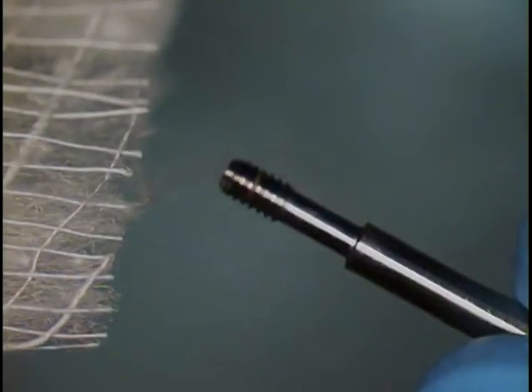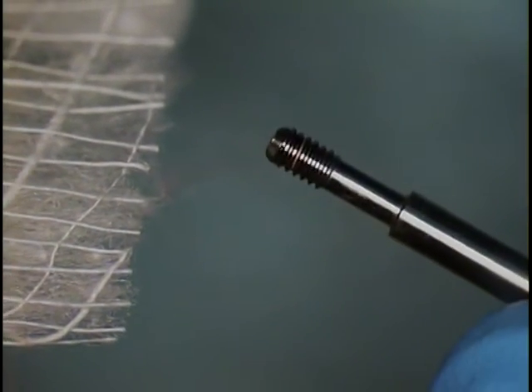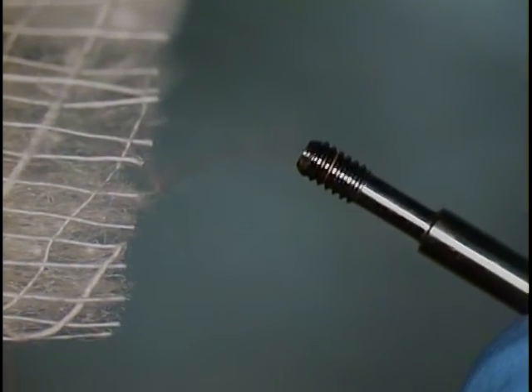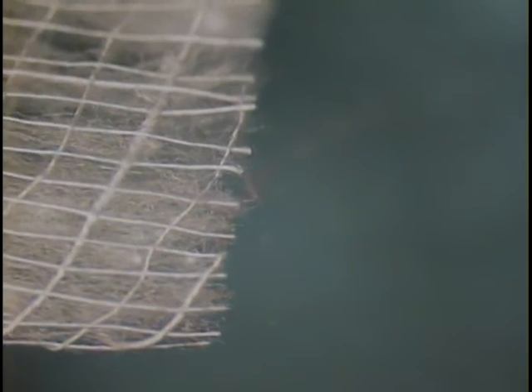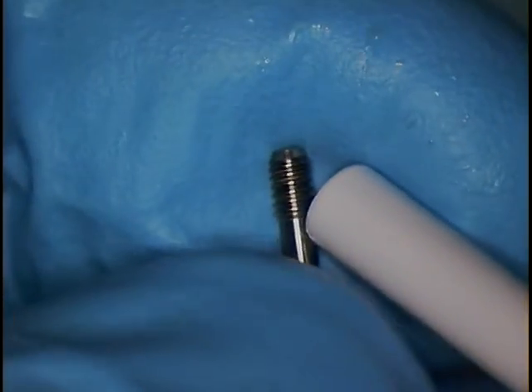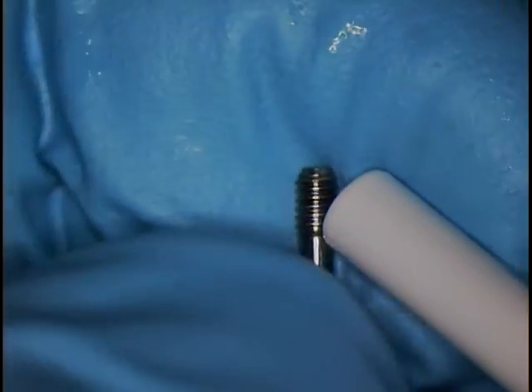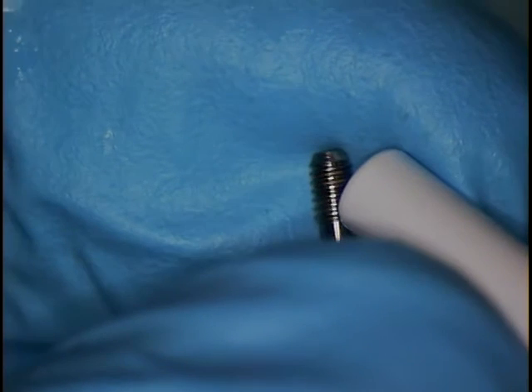Let's check the threads on our screw before we go back in there, just make sure there's nothing wrong. There might be some things on this right here. Let's dry this off. Absolutely. We're going to get rid of this screw because it picked up some of the tartar in there.